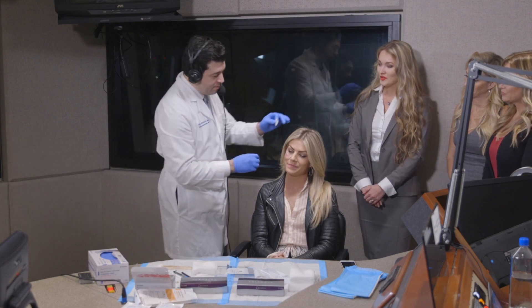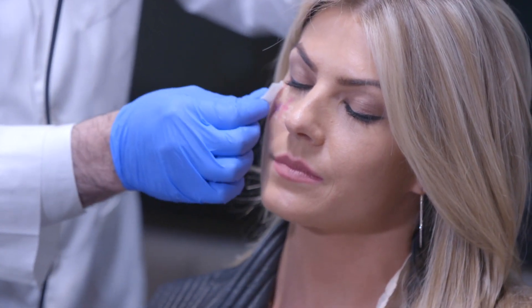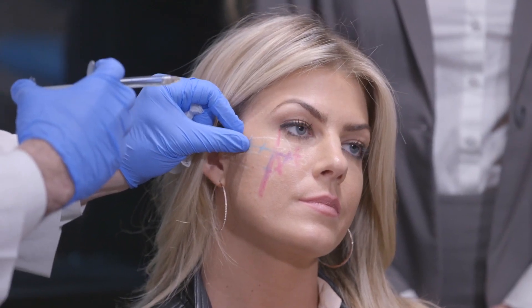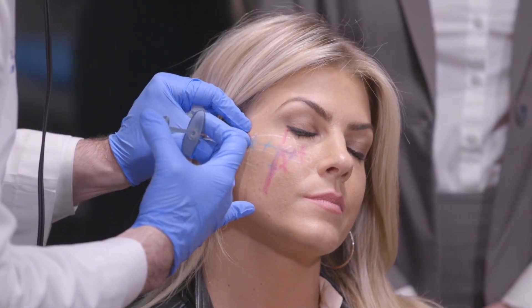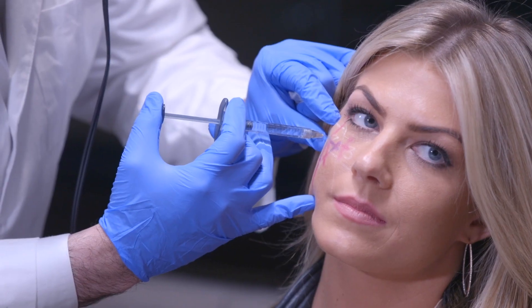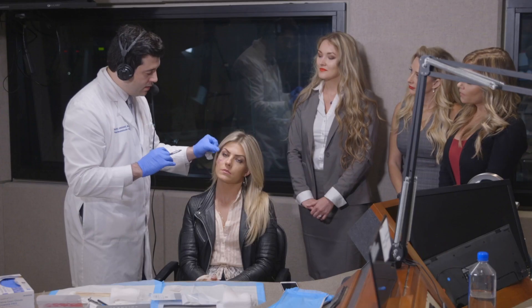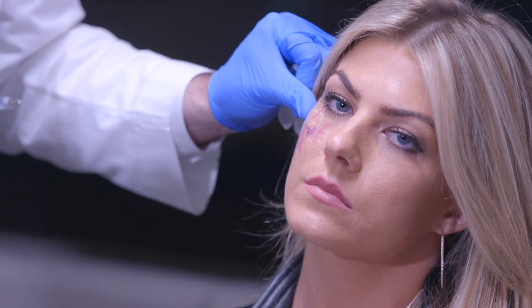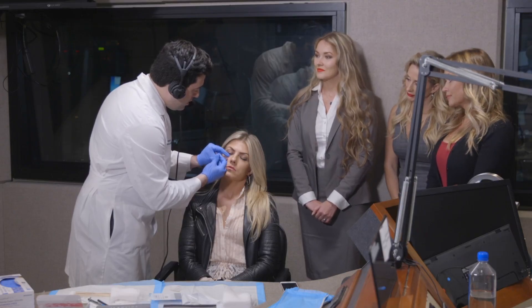We're going to start by cleaning up the area and putting a little bit of alcohol over where we marked, to make sure the area is nice and clean. Not to be fearful — it's going to feel like a little scratch. No pain because it's got lidocaine in it. Hold still, we're going to start with the outer cheek and work our way in. Very gentle — and she's doing fantastic, nice and calm. No pain at all. You can start to see the contour — very gentle, very subtle. We're on the bone, and she is done on this side.